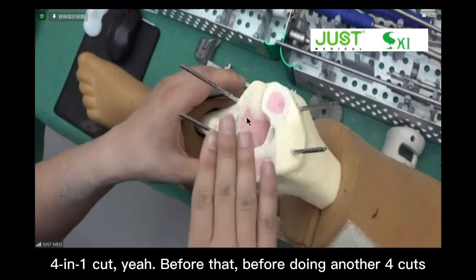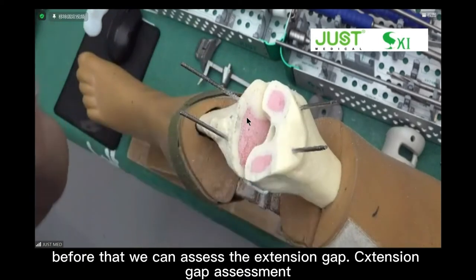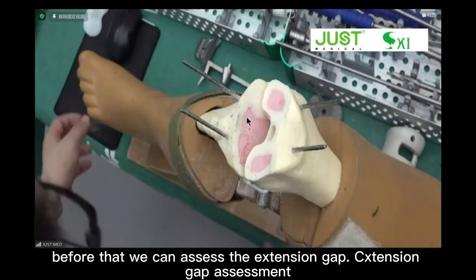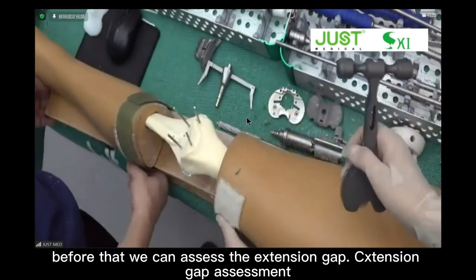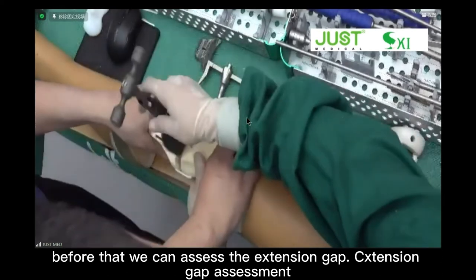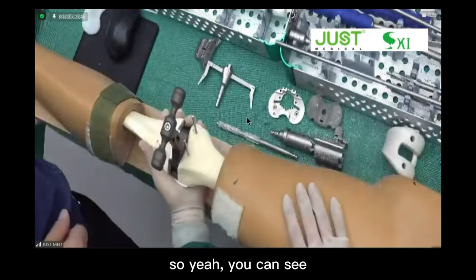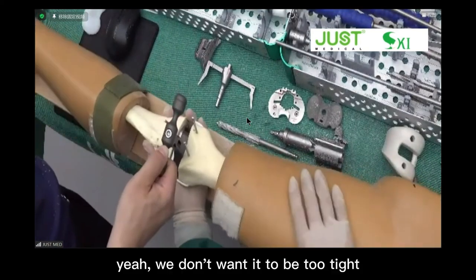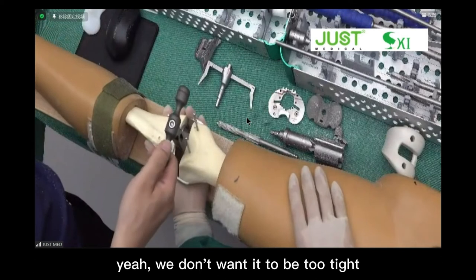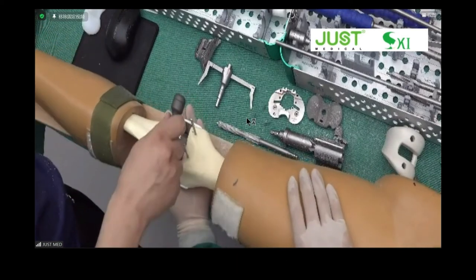Before doing the other 4 cuts, the chamfer cuts and the vertical cut, we can assess the extension gap. Extension gap assessment. We don't want it to be too tight. It cannot be too loose either. So it seems good.